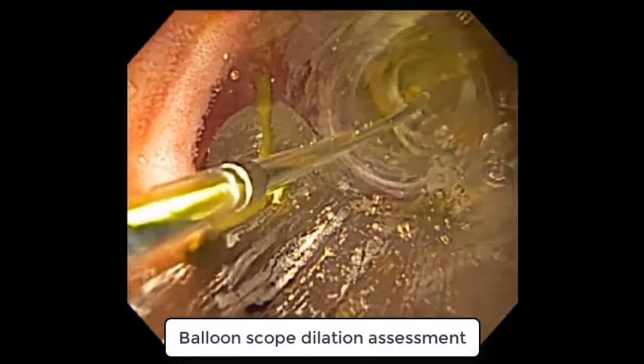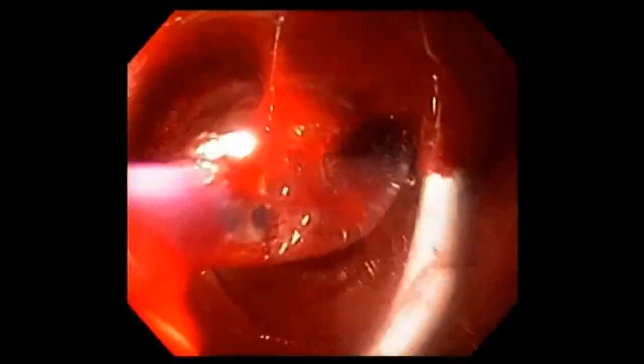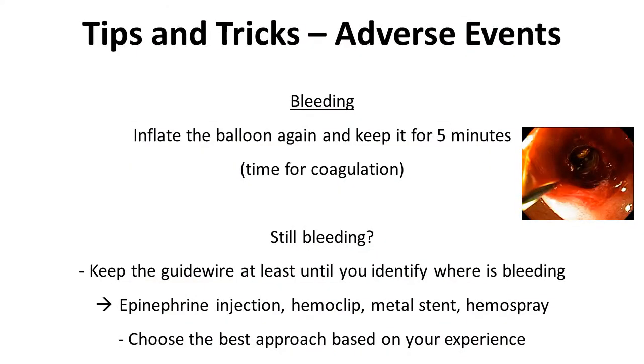When the balloon was deflated, moderate bleeding was observed. In cases such as this, we inflate the balloon again and keep it inflated for 5 minutes to allow for hemostasis.